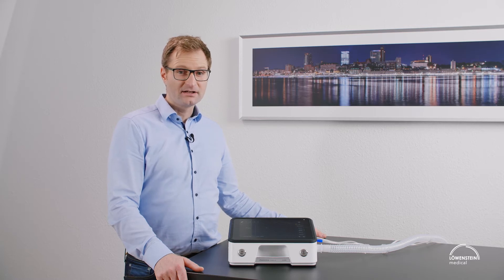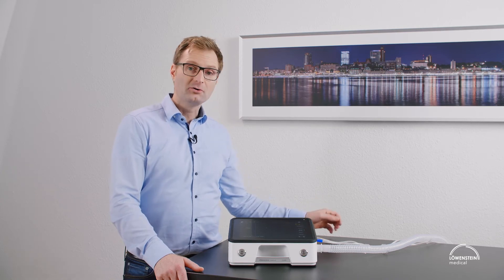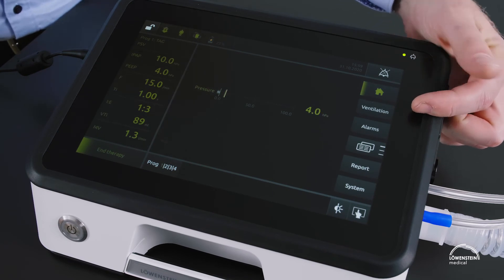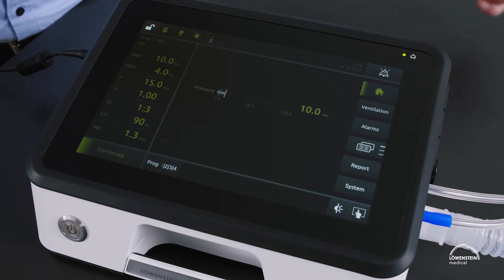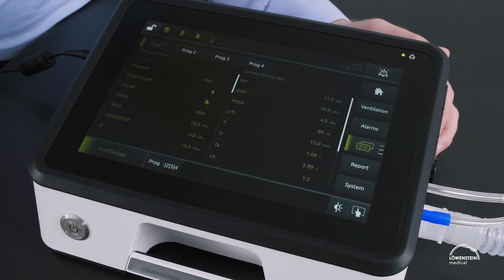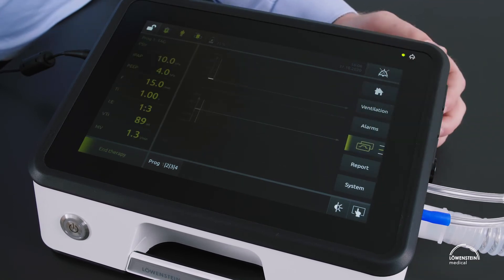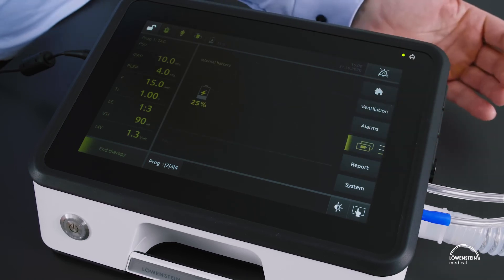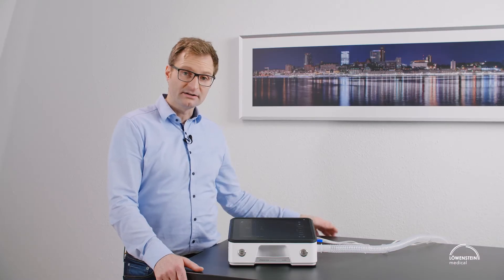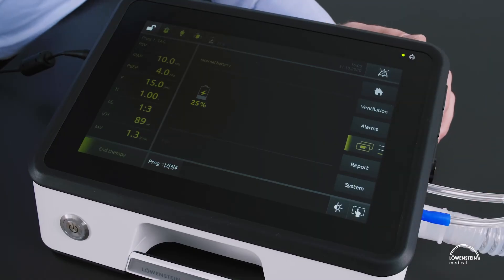On the right side of the display we see the actual menu of LUISER, starting with the home button and the ventilation menu for the actual ventilation settings, the alarm menu for the alarm settings. Here we have different views, for instance the documentary view, the curves and the mobility view or battery view. In the report menu we will find the alarm list, event list, or a combined alarm and event list, and the last one is the system menu.